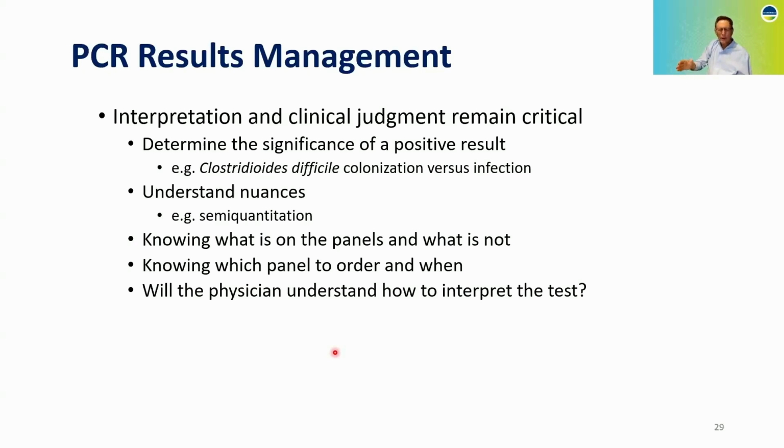And there's one healthcare system recently that implemented this panel. They are telling people what's positive and what's negative, but they're not giving them the semi-quantitation, which I think is a big problem in how you interpret these tests.